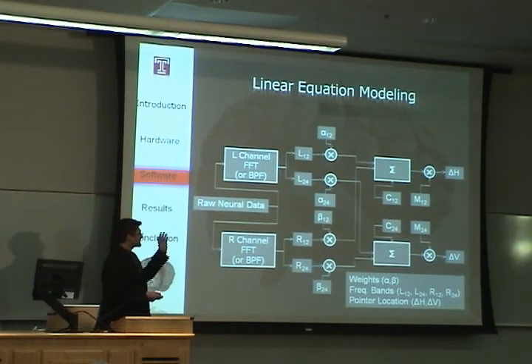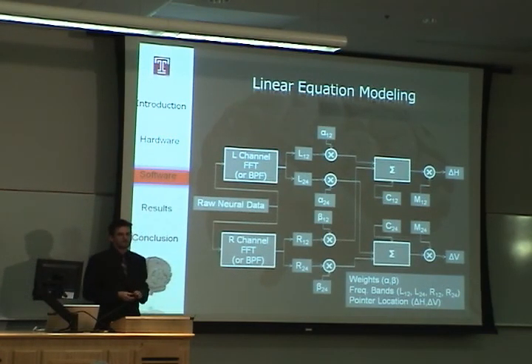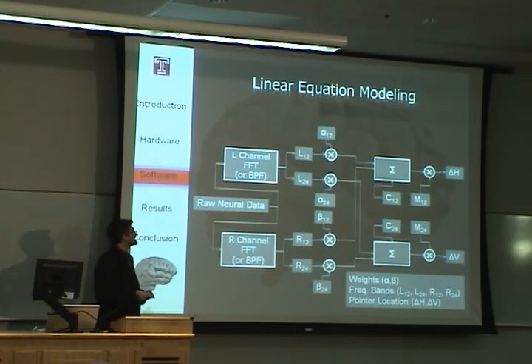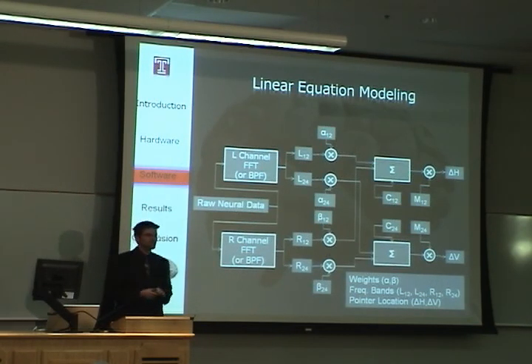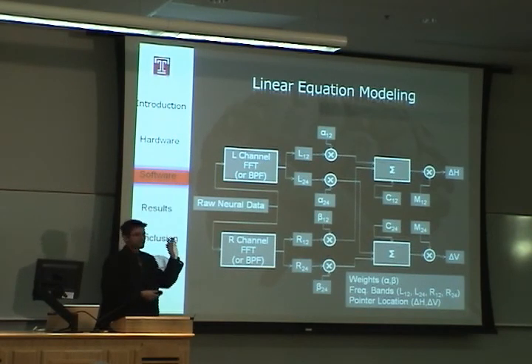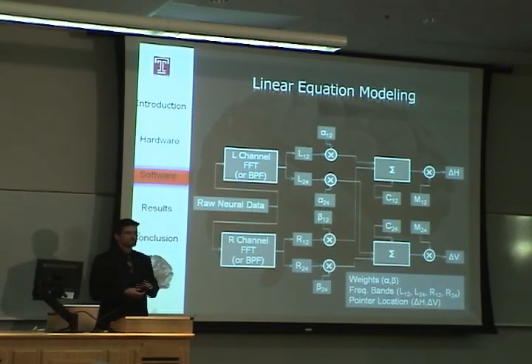And what's kind of happening here? You guys have all the raw data that comes in, coming in time domain, so from the brain, and we break it out into each separate channel. And in particular, we're only using 2 channels, and we do fast Fourier transforms. We pull out frequency data, pull out 12 and 24 hertz for each of the 2 channels. We augment that data with some kind of weighted multiplier. The weighted multiplier comes from another part of the project, which I'll discuss. For now, it's just a multiplier.